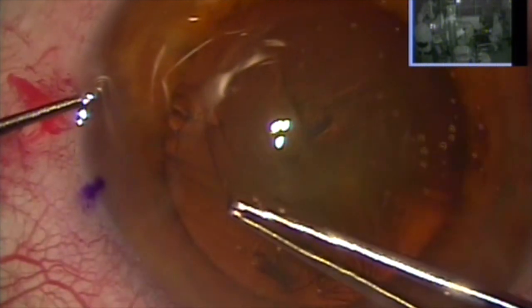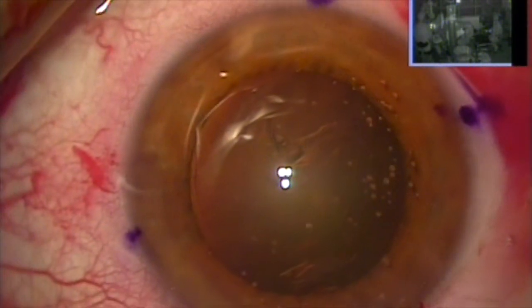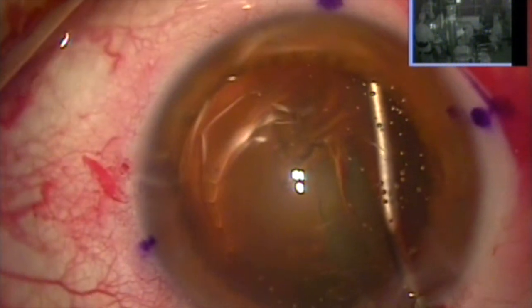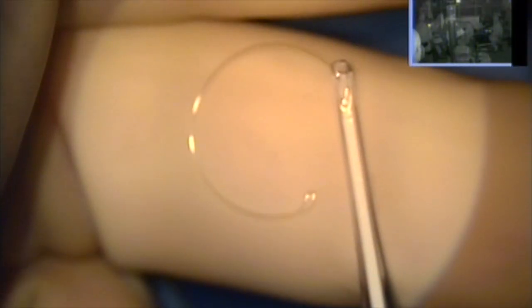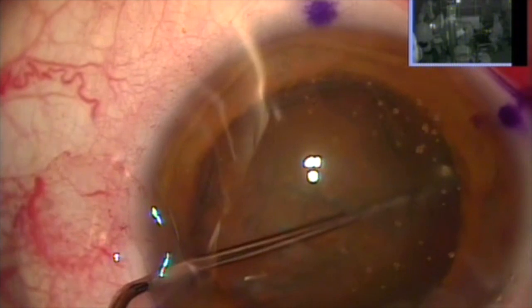So I'm attaining a good large capsulorrhexis here — larger than my normal. My normal is about five millimeters; this is closer to six. It's central. I'm going to do hydrodissection. And you can guess what the next move will be — I will definitely use a tension ring, and automatically have my team put an iris-fixated lens on standby in case we lose the whole capsule bag.